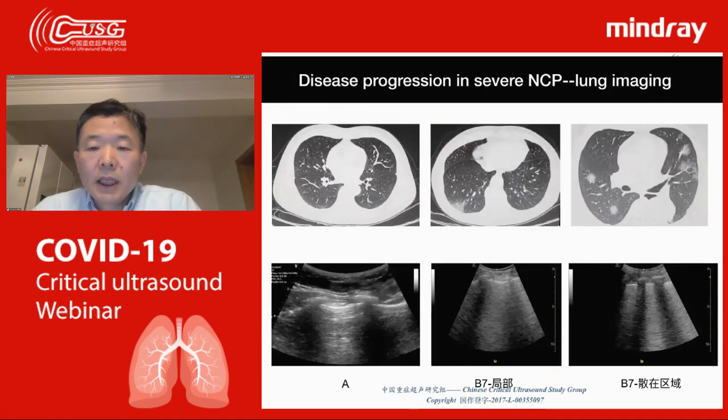So if we use this kind of tools, put them together, you will see some, we call it lung ultrasound at the point of care. Compared with CT scan, it is much more frequent. You can use it close to your patients, maybe every 6 hours, even every 2 hours. Whenever you want to, you can use the ultrasound to examine the patient. But the CT scan, you can't.